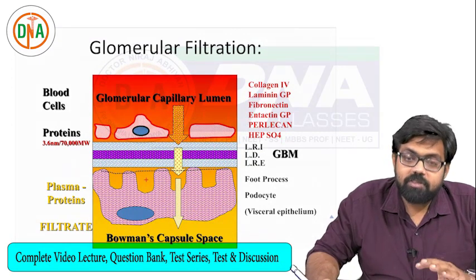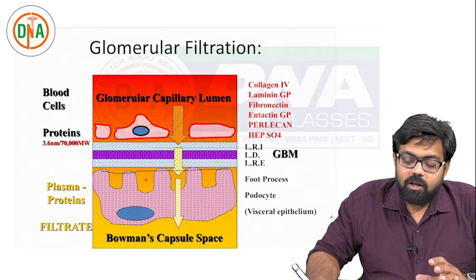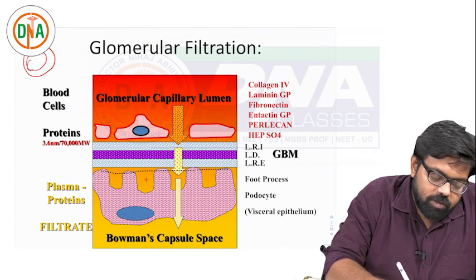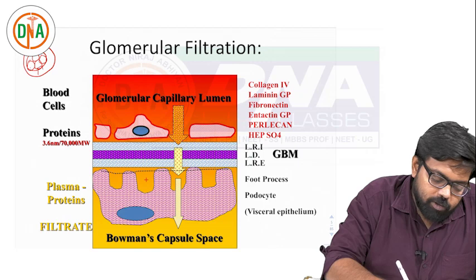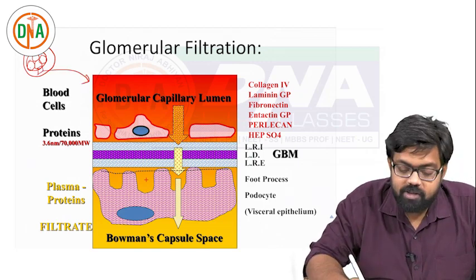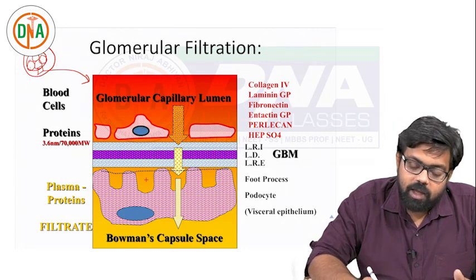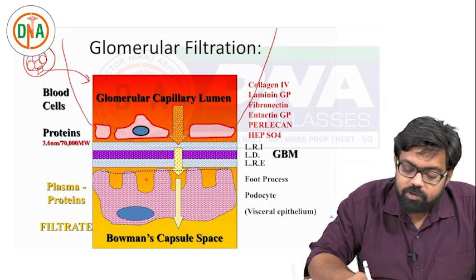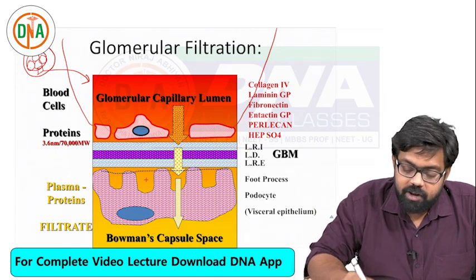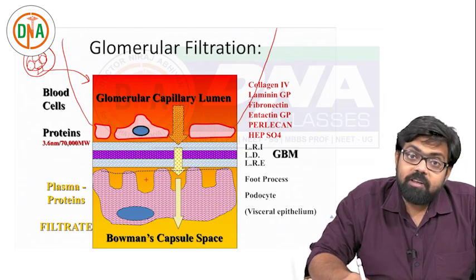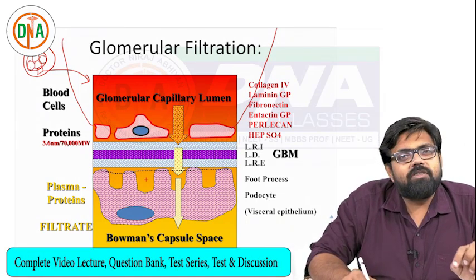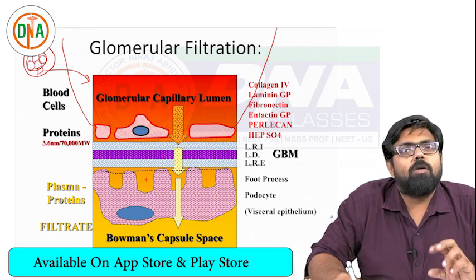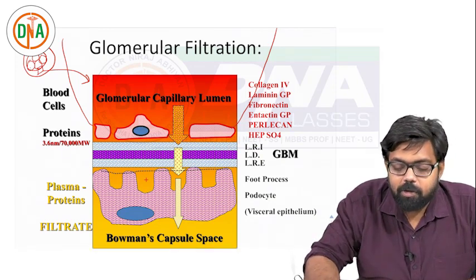This image beautifully depicts all the normal structures of the electron microscopic view of the glomerulus. Imagine a small part magnified - superiorly is the glomerular capillary lumen. What you are looking at are the fenestrations, which are 70 to 100 nanometers. The outer aspect shows the basement membrane, which has a central lamina densa, inner lamina rara interna, and outer lamina rara externa. The glomerular basement membrane is made up of type 4 collagen.